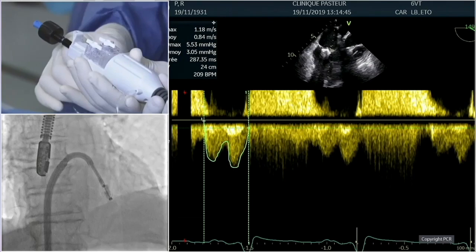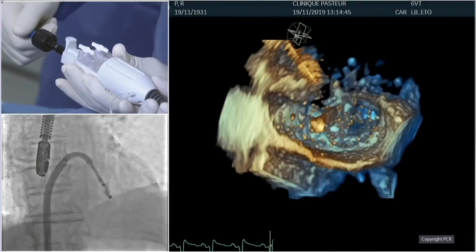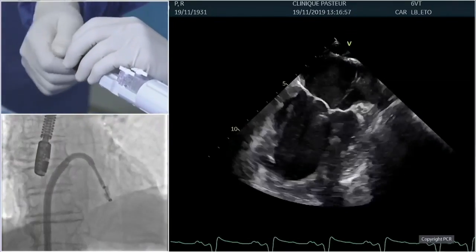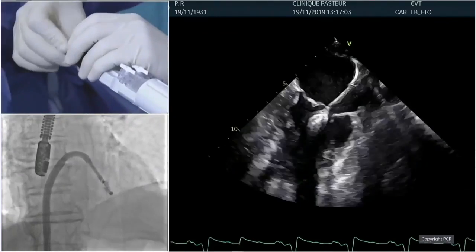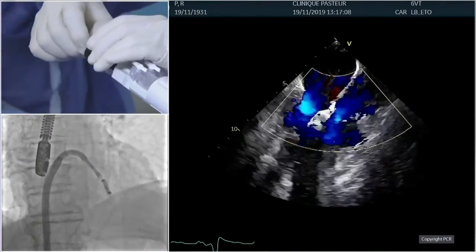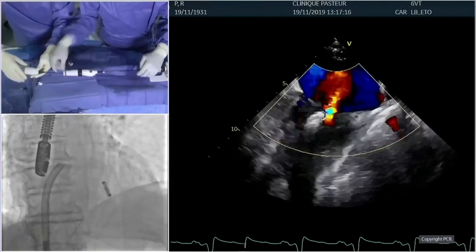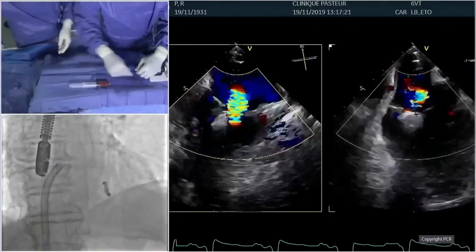I guess at the beginning, because it's a little bit of a bigger device, sometimes we were misled and thought that this will end up with high gradients. But because it has some compliance, and despite the fact that you achieve quite a thick tissue bridge, the leaflet mobility beyond that bridge is actually quite well preserved, and this is why, as they said in their experience and in our experience, when you implant a second device, the gradient sometimes does not go up at all, or maybe only 1 millimeter of mercury, because you also have to consider if you take away some regurg, that also helps you with ending up with good gradients, low gradients.